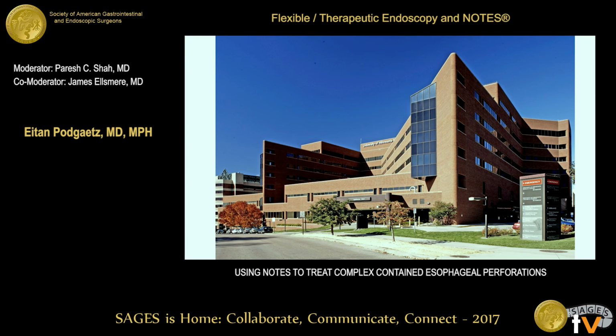One comment for the audience that doesn't do this is, the irrigation that you're achieving with the initial endoscopy can't be underrated. You can do a tremendous amount of lavage and debridement in a stable setting with the initial endoscopy. But thank you. That was a great paper. Thank you so much.